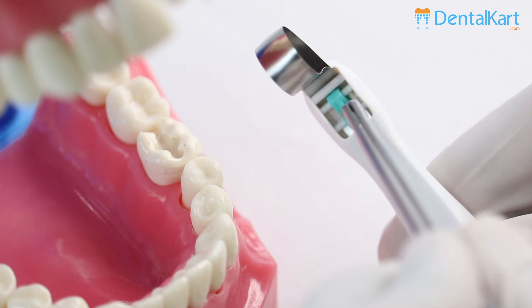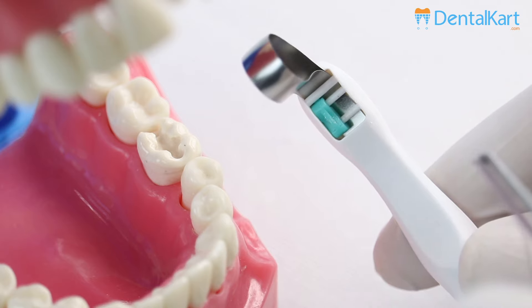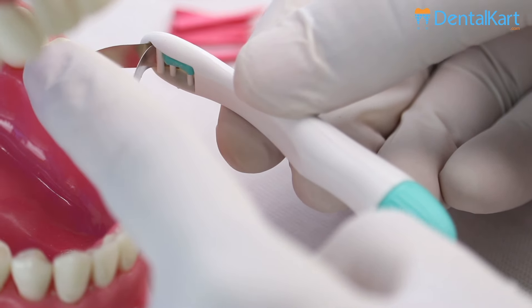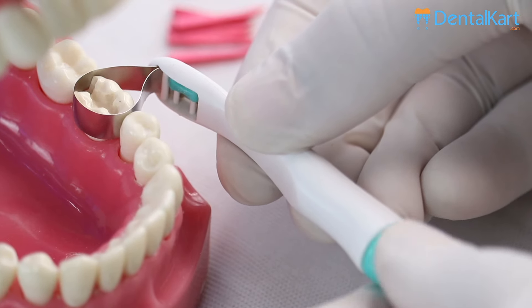Before use, adjust the toggle to suit the mouth quadrant in which the automatic matrices is being used. Place the band around the tooth and tighten by turning the thumb screw clockwise.